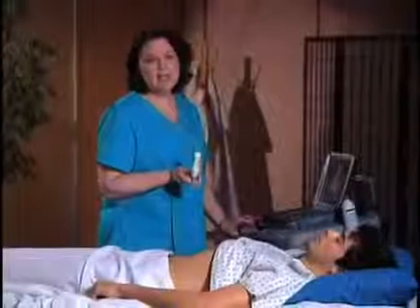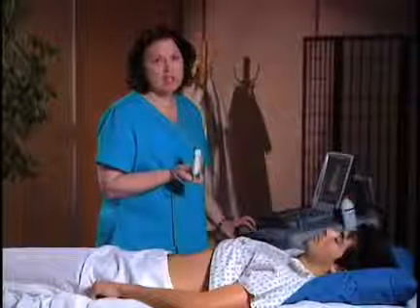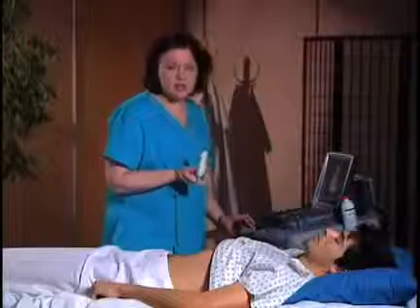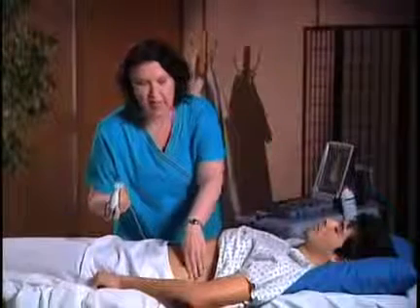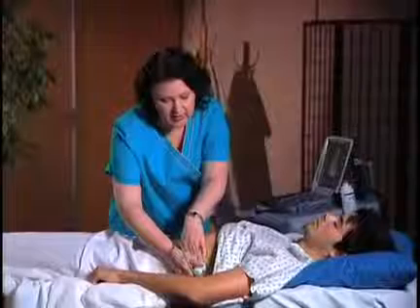An important part of a kidney evaluation is a bilateral comparison between the right and left kidney to determine if there's hydronephrosis present on one side versus the other. So we'll go ahead and do the left side as well. So an easy landmark here is just to identify the costal margin and then move up one hand's width and bring your transducer in at the mid-axillary line.